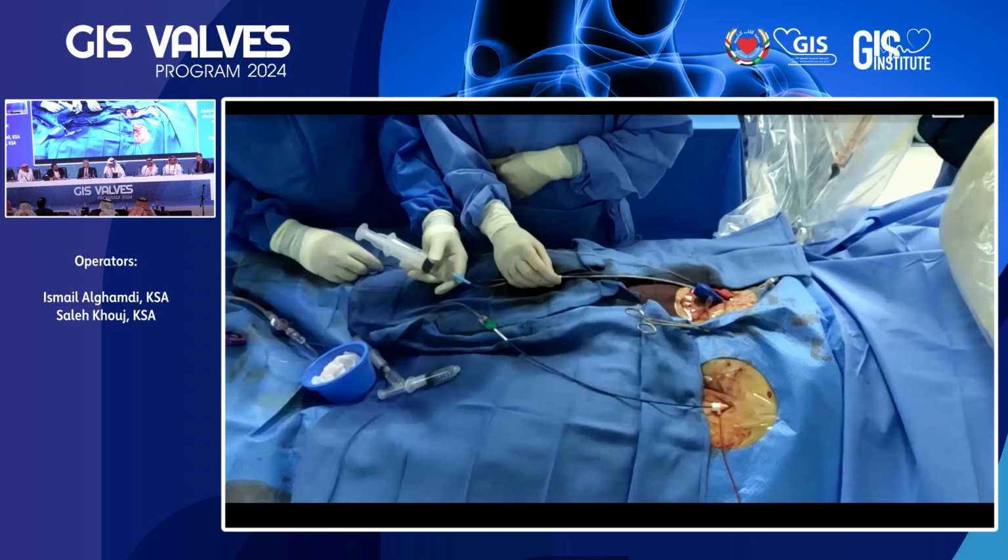And it's important that the point about the BAV was brought up, as to whether you need to balloon or not. Again, if you look at it, this is either more class 1 or type 1. And in general, I would lean towards balloon just for two reasons. One, it's a type 1 because they're usually more forgiving than a type 0 for balloon valvotomies, and also it gives me a safety in not getting the nose of the valve stuck on the way in.